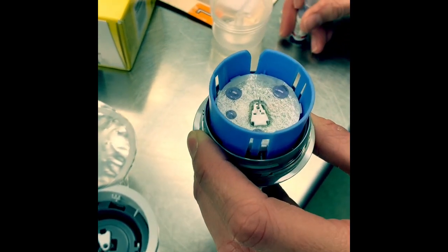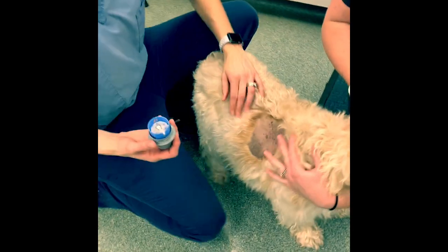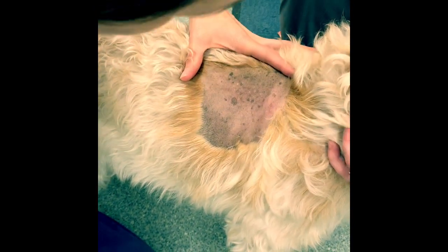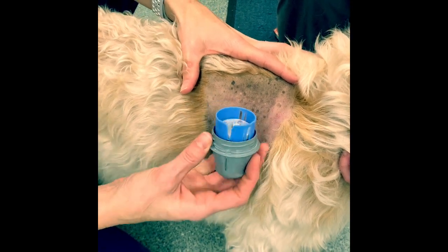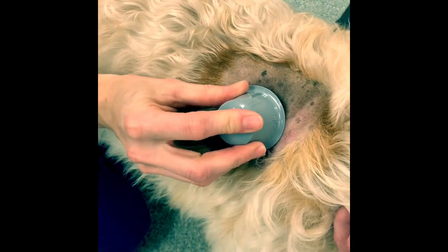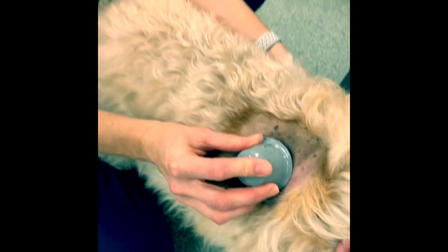We're going to put it on Mick's skin in our prepped area and we want to hold it in place for about 30 seconds to make sure that everything stayed on there as nicely as it should.